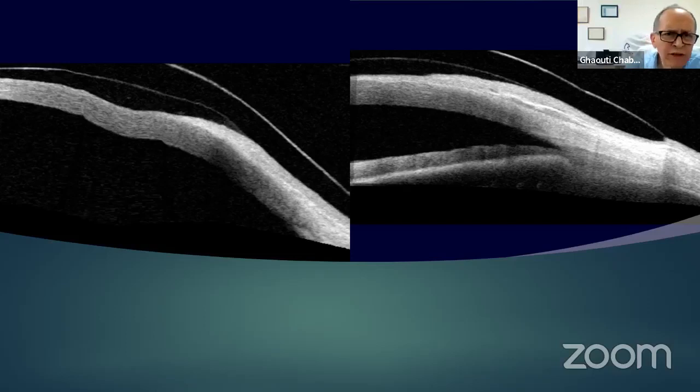For ocular surface complications such as ocular surface disease, dry eye, and so on, how much clearance do you advise people to do with 17? I would try to be after the lens settles down. That's as important because sometimes these lenses can drop 100 microns. So after the lens settles down, I would want at least 200 microns of clearance, at least.